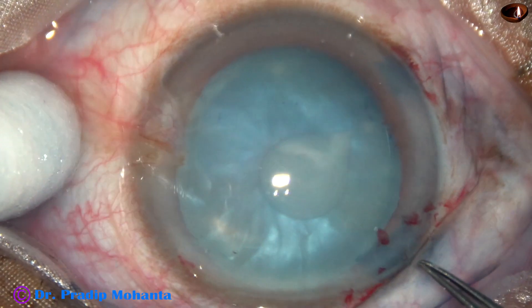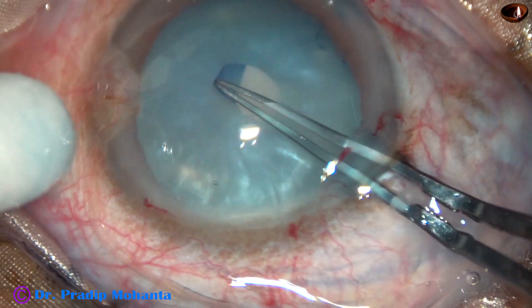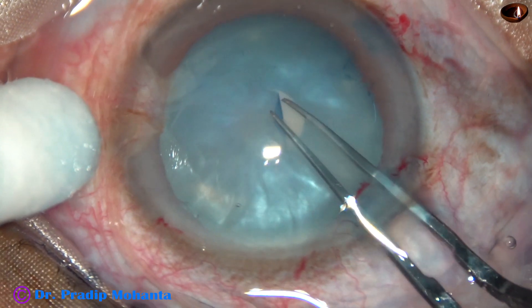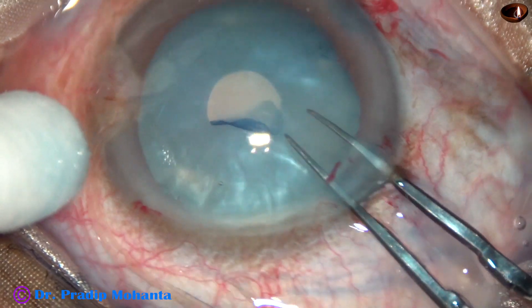You can see some fluid comes out, which indicates that the intralenticular pressure is raised. Now do a small rexis — a mini-rexis.